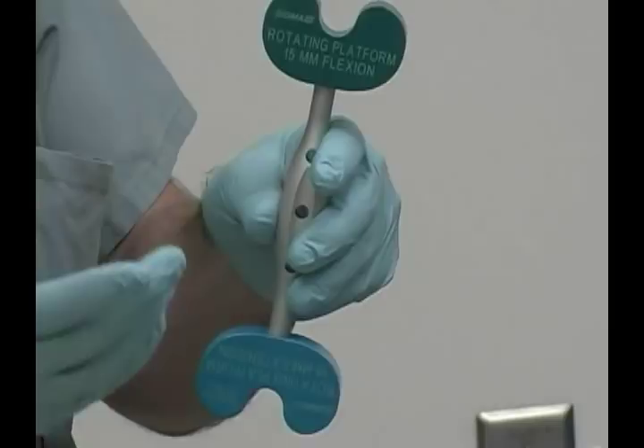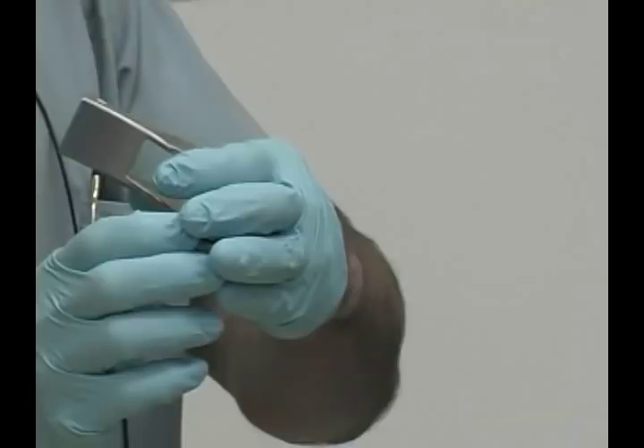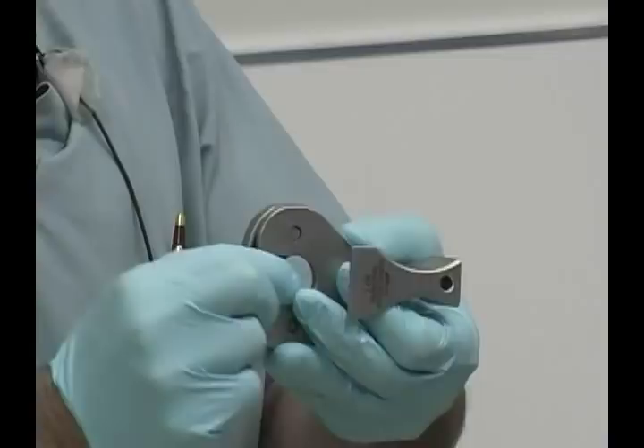Spacer blocks are used in extension to establish the size of the extension space at whichever millimeter insert would be chosen to achieve the required stability with the femoral positioner. They are size specific, based upon the size of the extension space that was previously established.